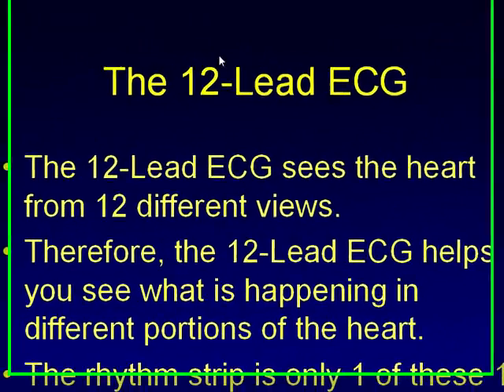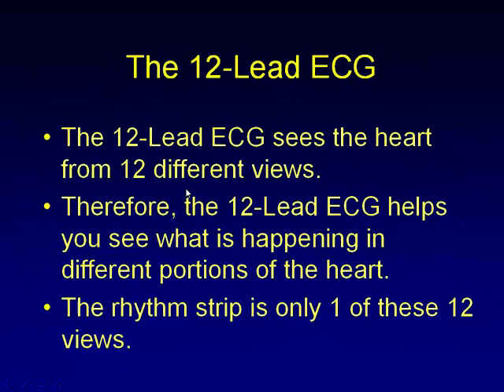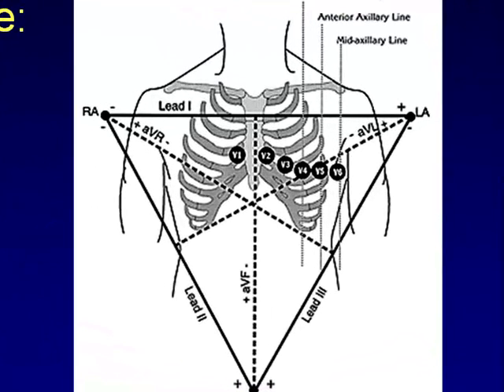Yes. So the 12 leads, we divide them into 2 groups. The first group is called precordial leads. There are 6 precordial leads, and the other 6 we call limb leads. The 6 limb leads we divide further into 2 portions: the augmented limb leads, which we sometimes call unipolar limb leads, and another group, the standard limb leads, which we also call bipolar limb leads. We will tell you why we call them this, okay? So please listen well and look very well at these 12 leads.